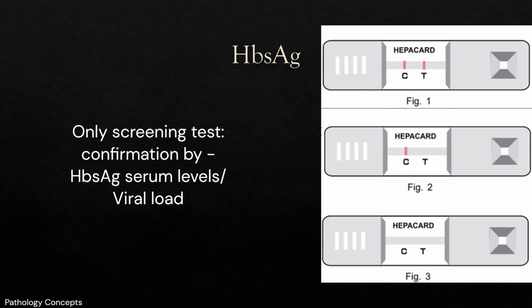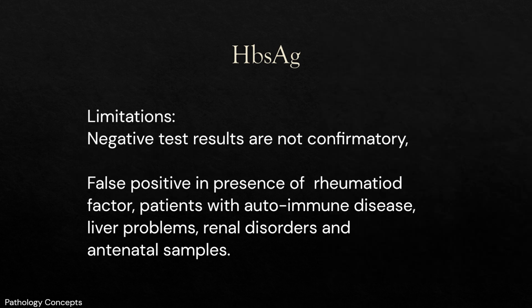HBsAg. This is only a screening test for hepatitis B virus. All reactive samples should be confirmed by confirmatory test. False positive result can be obtained due to presence of rheumatoid factor, patients with autoimmune diseases, liver problems, renal disorders, and antenatal samples.